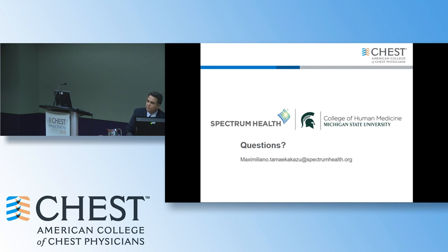I don't think that the rate of pneumothoraces were higher because of what he alluded to. If you're going to jack up the pressures that high, you're trying to monitor the transpulmonary pressure, and in the example I showed, I think you went from like 24 to 32, which is really high, right? You're monitoring that end expiratory occlusion pressure, the transpulmonary pressure, so you're not letting it get above 10. So theoretically, if you're monitoring it, it shouldn't happen. Without it, at least theoretically, you could run the risk of getting higher.